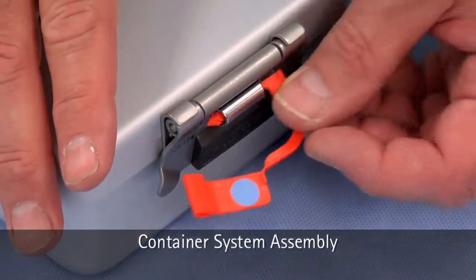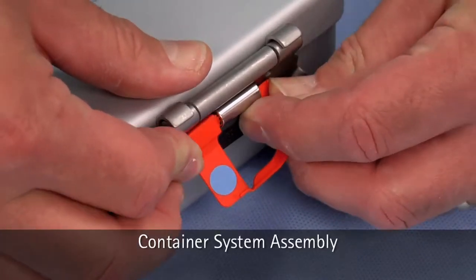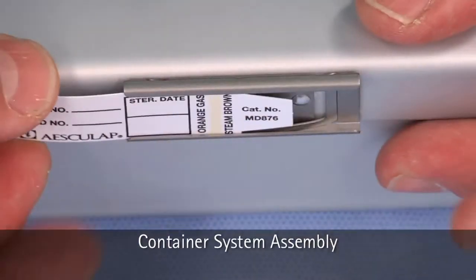Next, install the tamper-proof lock. Finally, install the optional indicator card.